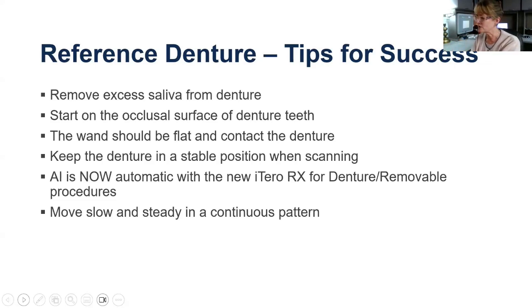And the reason I do that, it's not for the scanner necessarily. Like iTero, for instance, scans strictly off of topography. So the color of that Dr. Thompson stick ink doesn't have anything to do with the accuracy of the camera's acquisition at all. All it does is create a pattern for Kelly's eyes and Kelly's brain to follow while I'm scanning intraorally.